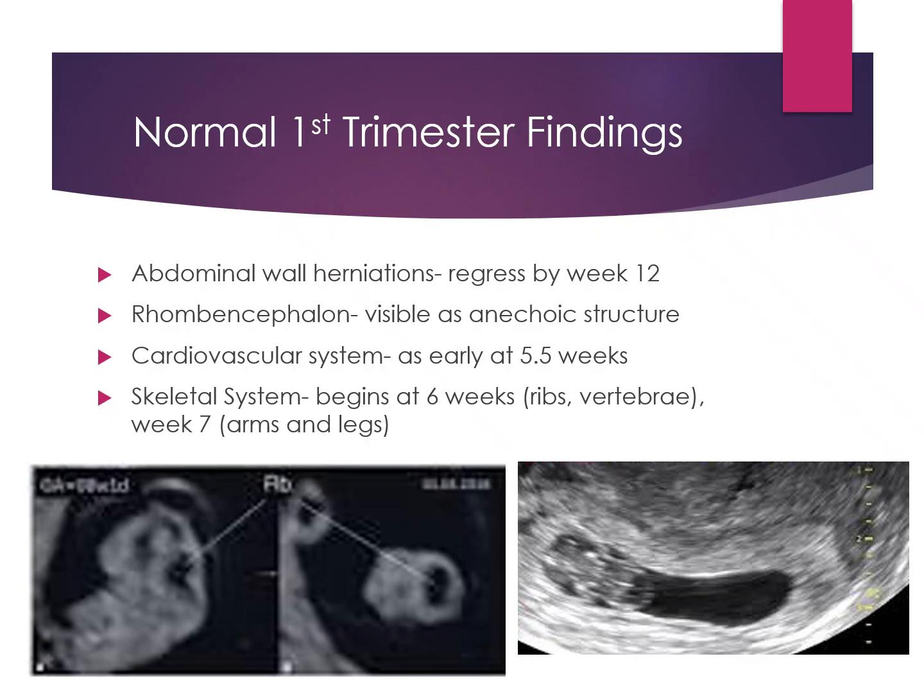In the embryology, or the stages of creation of an embryo, they may commonly have what's called an abdominal wall hernia, where the abdominal wall is protruding outside of the fetus's belly. We do not expect this to progress into the second trimester. So if you see it in the first trimester, you may or may not document it. We'll probably follow it up into the second trimester.